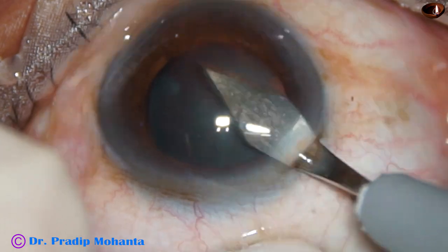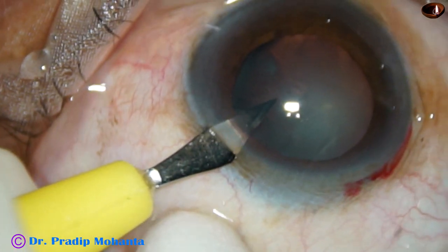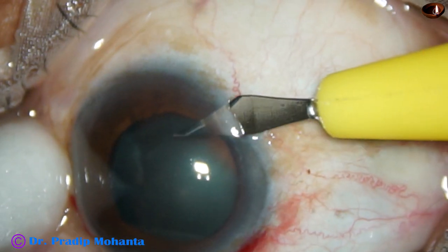This is the main incision at 11 o'clock. One side port at 1 o'clock. Another side port at 8 o'clock.